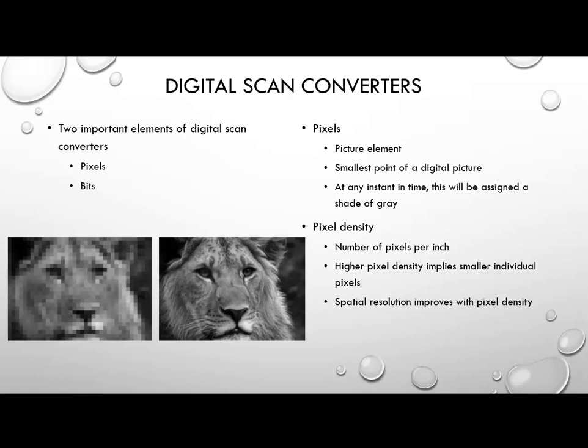Okay, so more on digital scan converters. There's two elements of the digital scan converter that are important for you to understand, and that is the number of pixels and the number of bits.